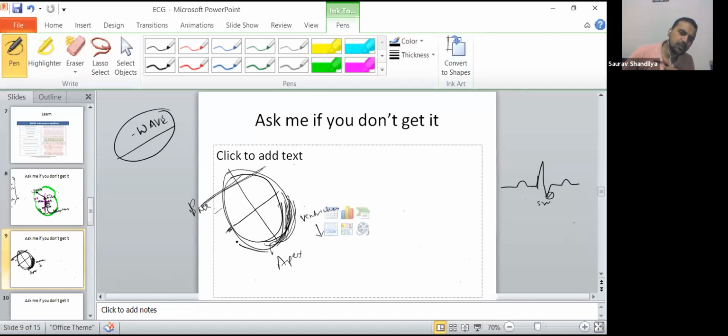Where are these waves going? Just try to imagine these waves. What I was saying from the septum, when it came like this, where these waves are going, going on top. Here when it starts repolarizing, this part is still to be depolarized, at last to be depolarized. I'm telling you, my friend, the S wave is basically this part. It indicates the ventricle's last part. You know why it is happening?